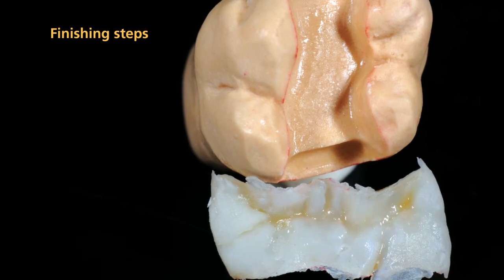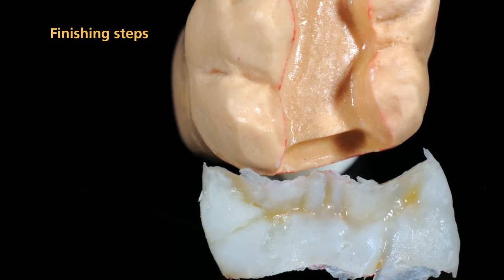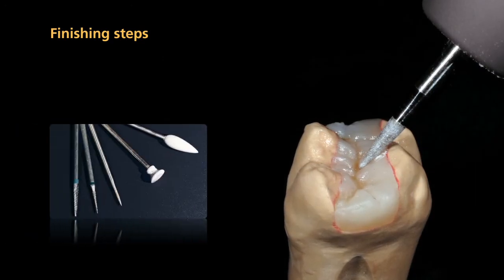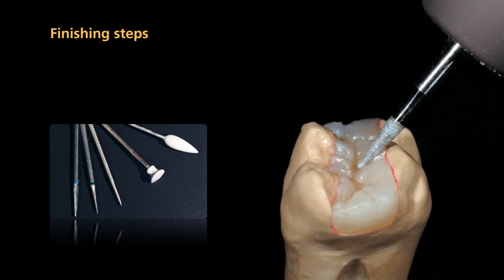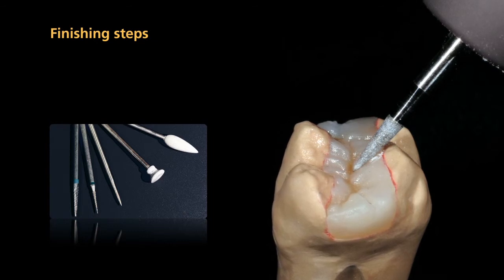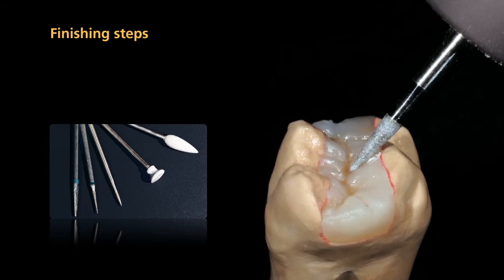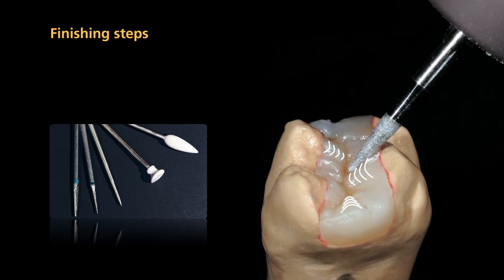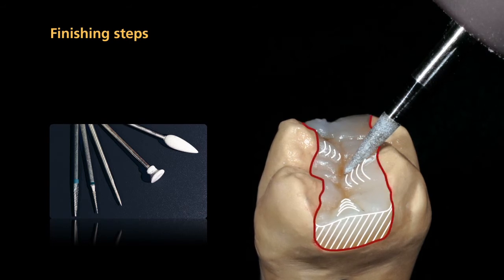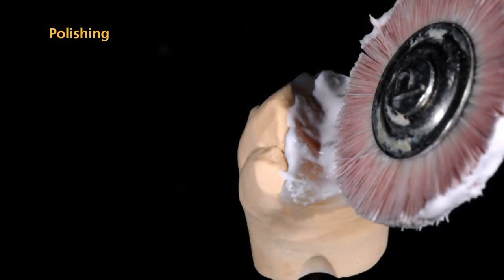After completion of the polymerization process, completely remove SR gel using running water and carefully remove the restoration from the die. Finish the restoration with cross-cut tungsten carbide burrs and fine diamonds. It is important to use low speed and light pressure to finish the restoration. Remove the thin inhibition layer and establish the shape and surface structure. Carefully smooth out the ridges of the occlusal surface and the proximal surfaces with rubber polishers.